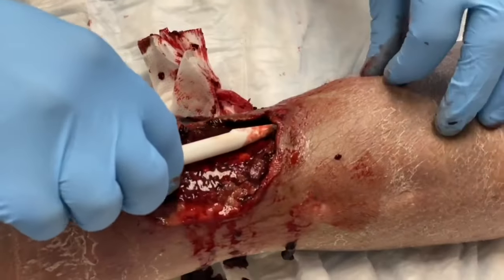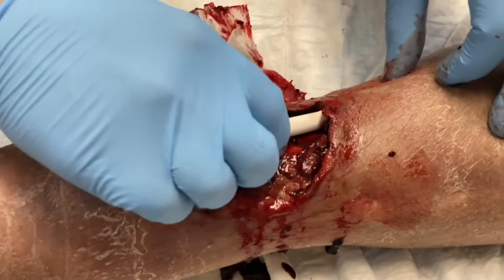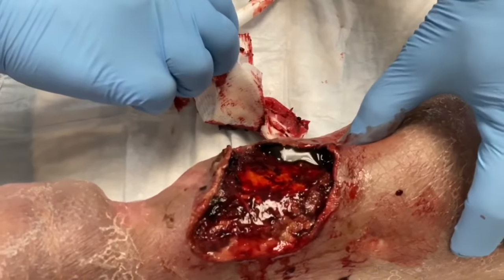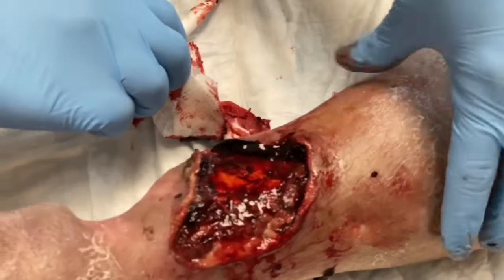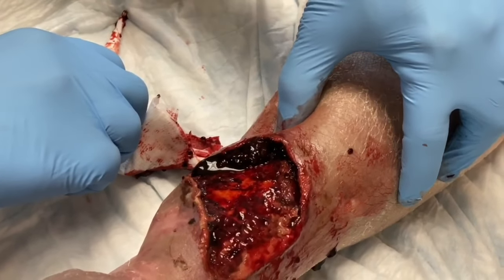You'll see here we're using our curette as a probe to look for any further dead spaces, because if we don't evacuate them or drain any of this dried blood, it can create more problems for the patient and even cause more tissue necrosis — so instead of it being a wound this size, you'll see an even larger wound.